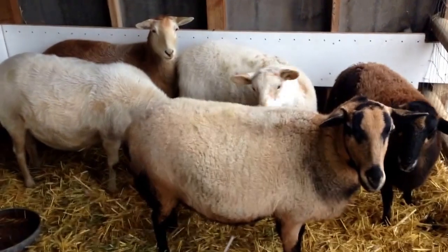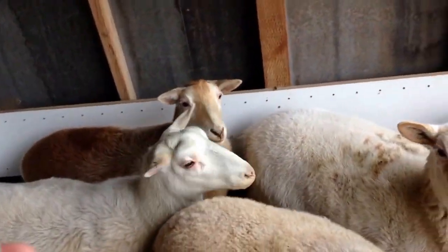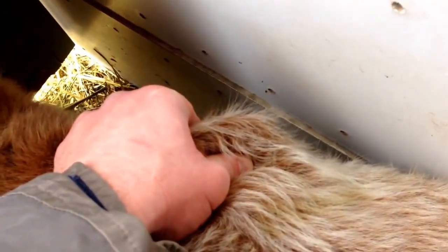Now let's get a sheep into a corner. I keep the needle away from the sheep. I have a sheep in the corner there. What I'm going to do is grab right at the base of the shoulder and pinch it up. You can see where my thumb is — I'm going to go right beneath that thumb and insert subcutaneously, which means below the skin, and then inject the vaccine.